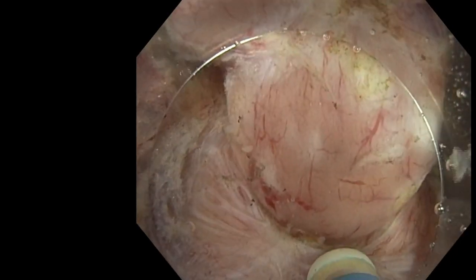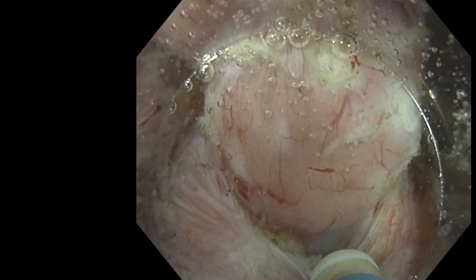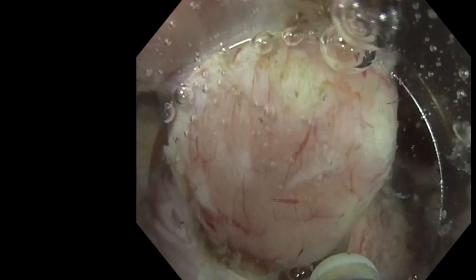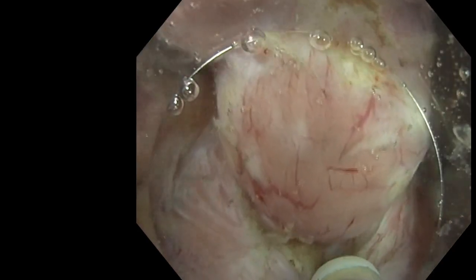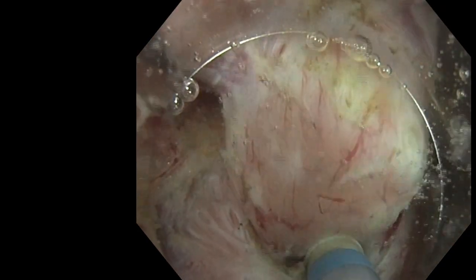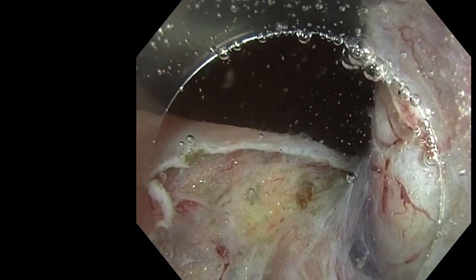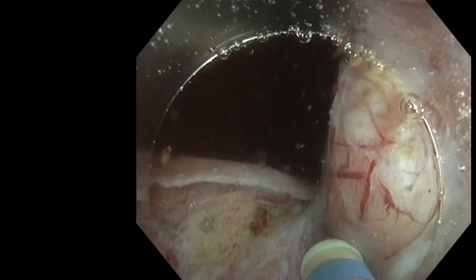And you will see that we will reach the bottom of the diverticula, because during the injection here, you will see, it will increase the space, showing that there is a communication between here and the opposite side of the submucosa. We could see that it changed the shape of the diverticula to inject. So we know that we are at the bottom now.